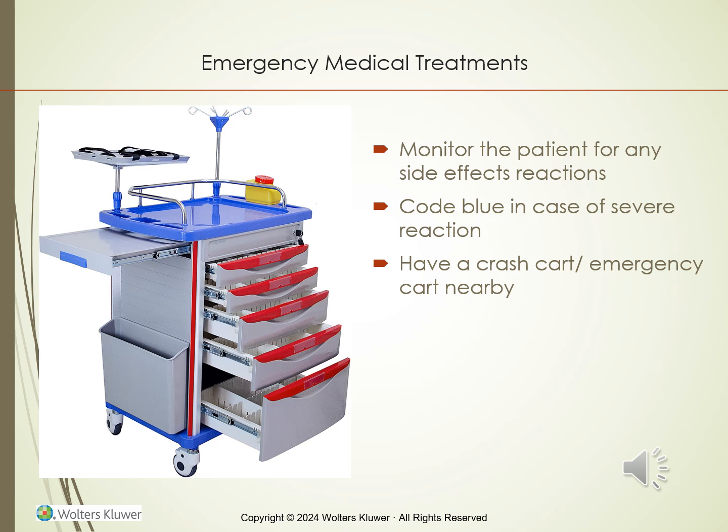Radiographers should closely monitor patients for any types of reactions, whether using a pressure injector or a hand injection. When patients are receiving contrast, the radiographer should maintain continuous communication with the patient and listen for any changes in their voice as well as their breathing, which may indicate laryngeal swelling.